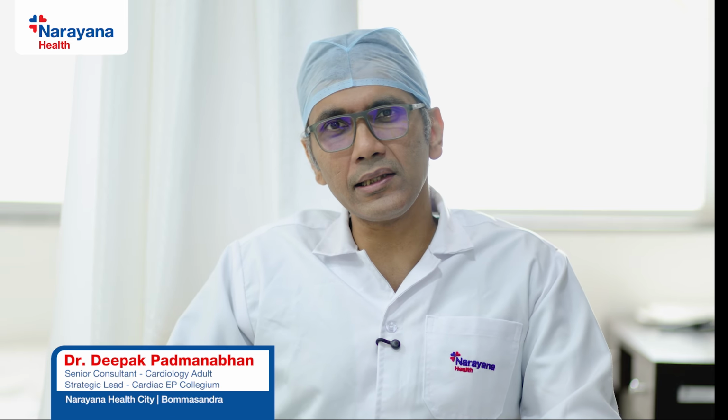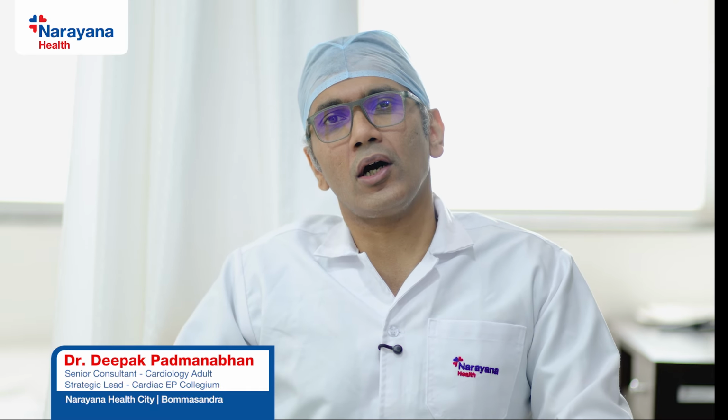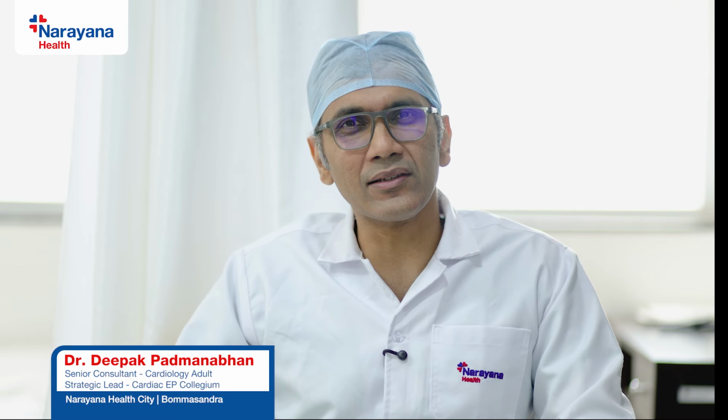Let's do a small little tutorial of sorts on what an ICD is and who should get one. An ICD is an implantable cardiac defibrillator. It is something that you implant in patients, commonly in someone who's had an abnormal rhythm called a ventricular arrhythmia, or in someone who has had a previous sudden cardiac arrest.